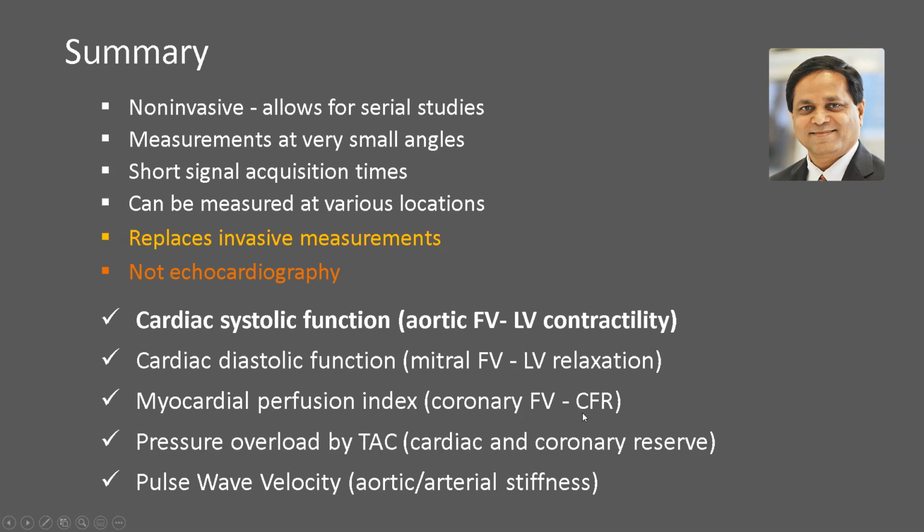Myocardial perfusion index, which is coronary flow reserve. We showed examples of TAC and how we can look at cardiac function as well as coronary reserve in this model. And we talked about aortic, or arterial, stiffness.